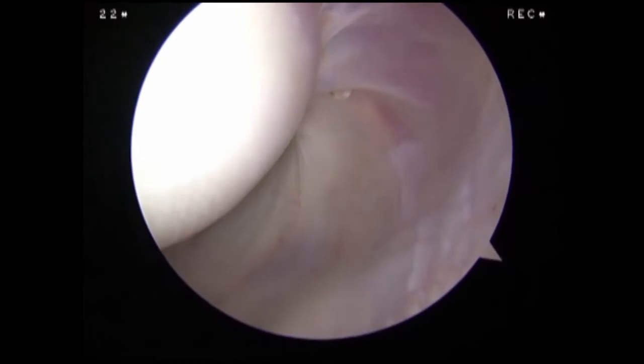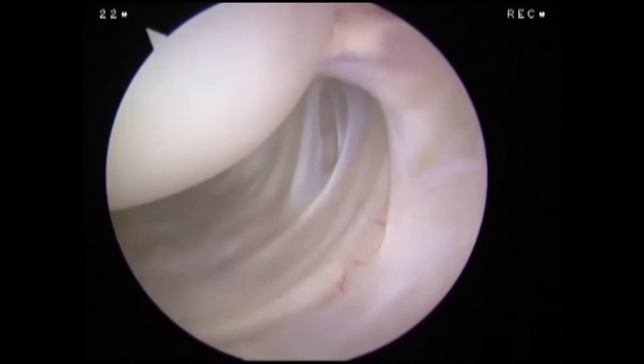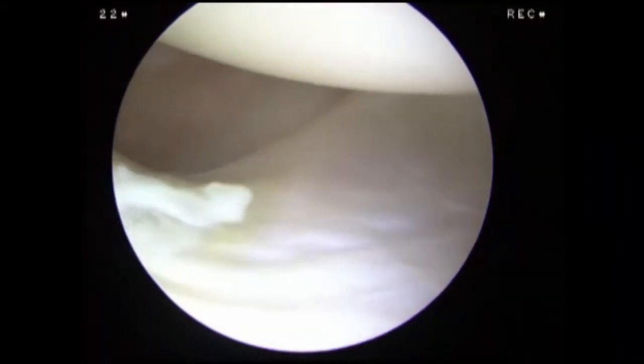In this position, we assess the capsule and the attachments of the glenohumeral ligaments to the humeral head. We then rotate the arthroscope anteriorly and medially to examine the posterior recess before returning to our starting position.